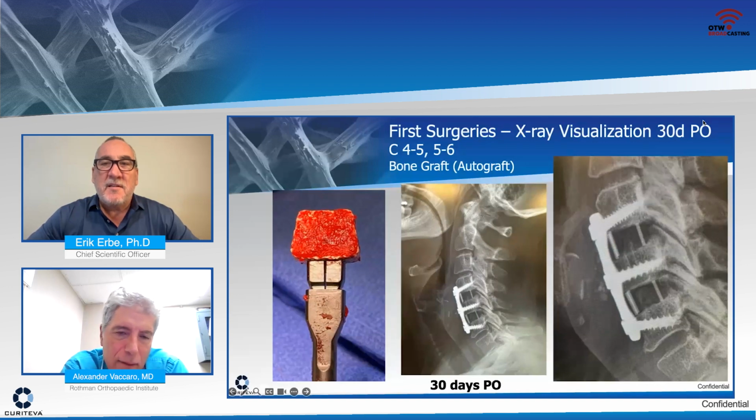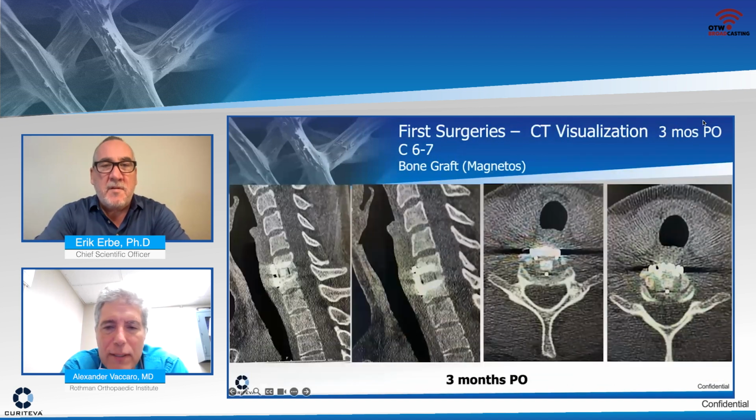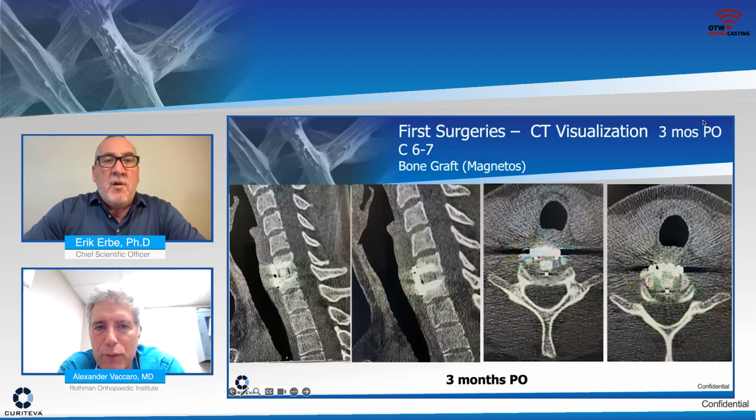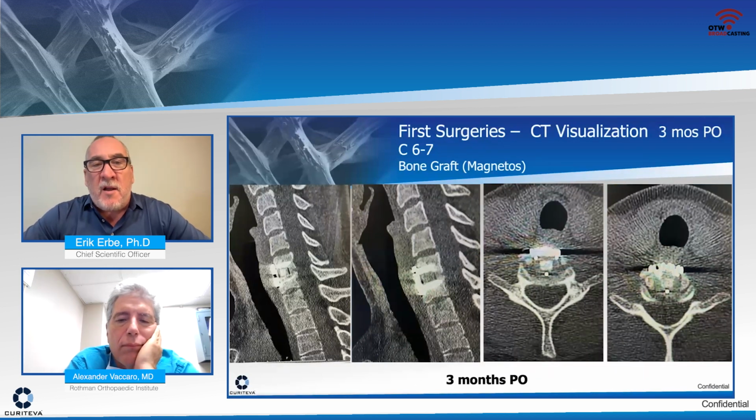And then you place it in, again, another technically perfect procedure as evidenced by the lateral x-rays. There's this superimposition of the different anterior and posterior borders of the graft itself. Here's another example on the following slide of a single level fusion, and you can see over time, at 3 months, you start to see blurring of the respective end plates that are opposed to the interbody spacer, and a well-positioned graft. So hats off to this surgeon. Another well-done surgical procedure.